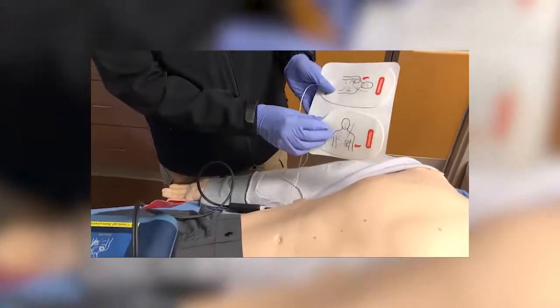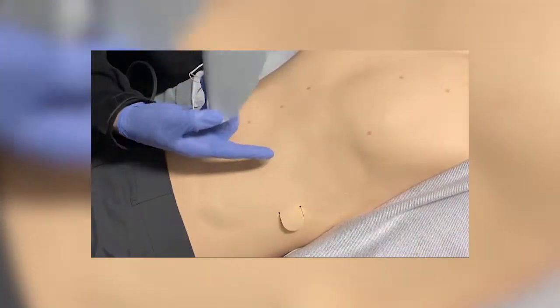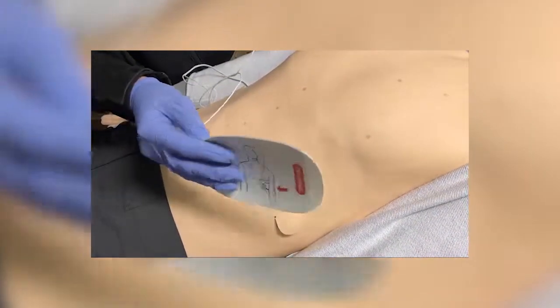Placing the pads on as shown on the diagram, as you normally would. There is a small indentation where the pads should go, which is normally where they would go.